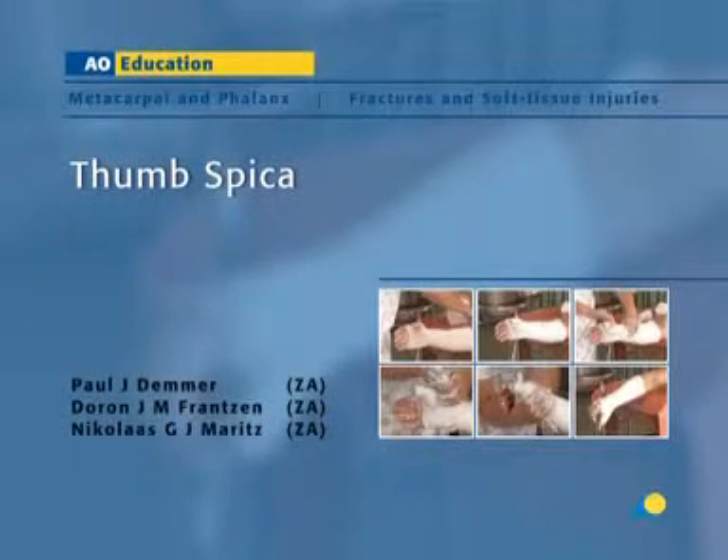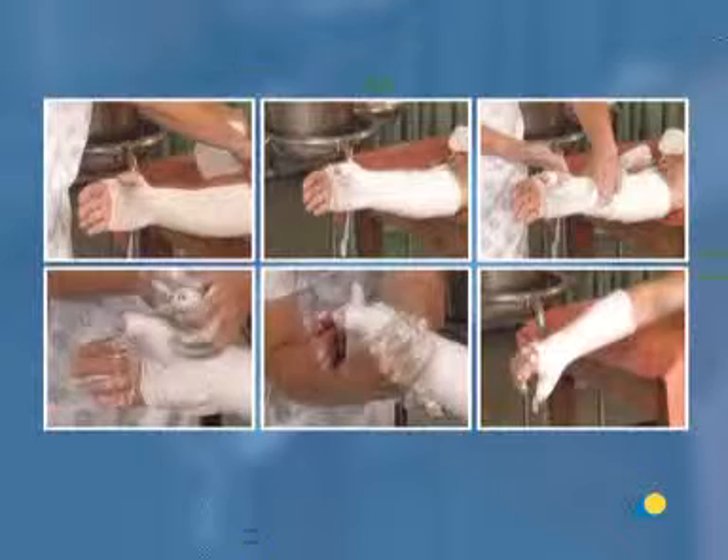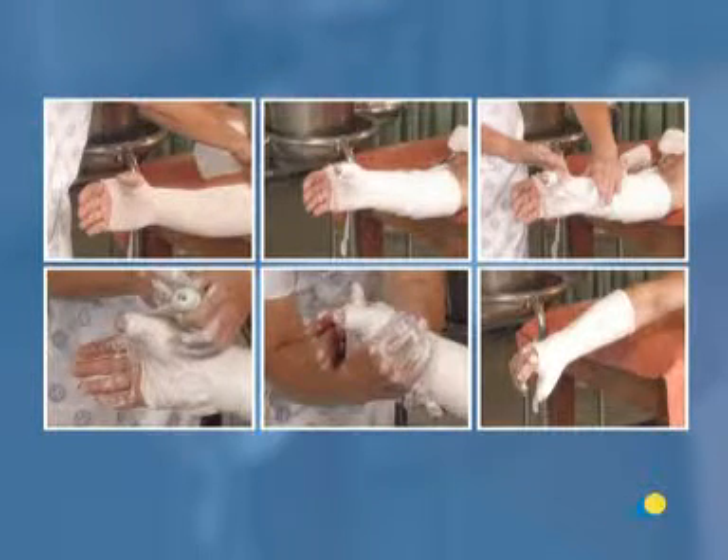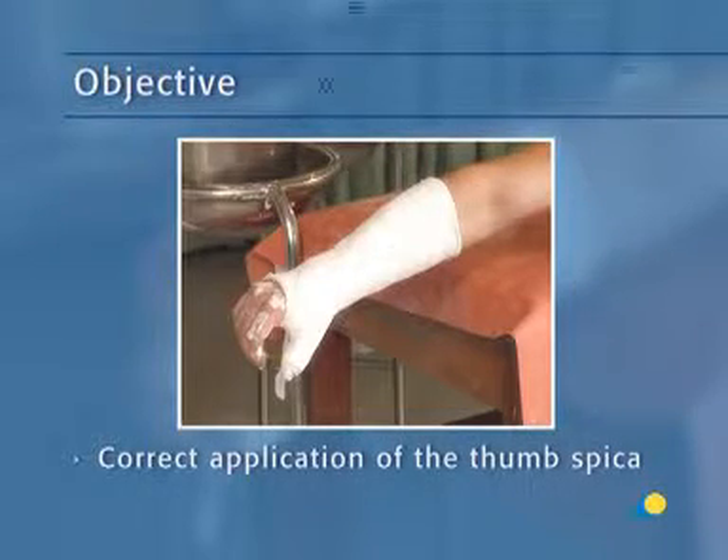The thumb spica is a circular plaster used to immobilize the thumb. In this presentation, the application of the thumb spica will be demonstrated. The objective of the exercise is to understand the correct application of the thumb spica.